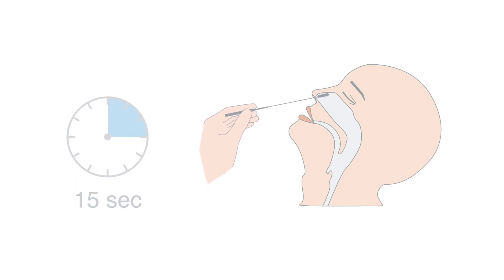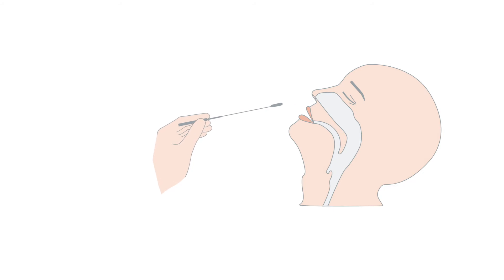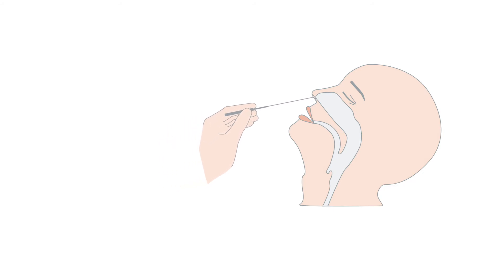Remove the swab from the nose. Using the same swab, repeat the process in the other nostril.